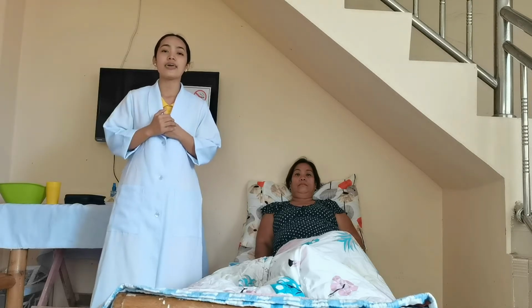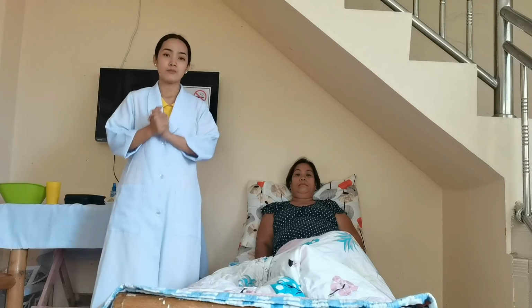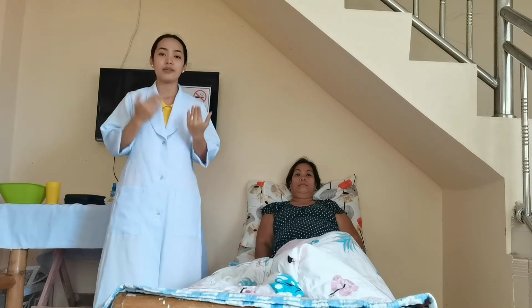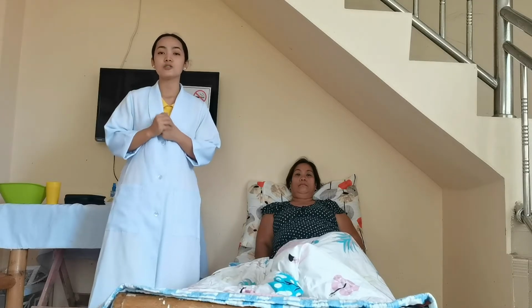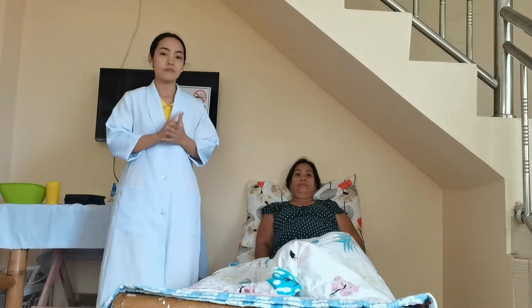So for the assessment, we have to assess the client's lung sound before and after the procedure to provide baseline data and also to assess the effectiveness of the medication. We also need to assess the client's oxygen saturation before administration of the medication. And lastly, we need to assess the client's level of consciousness to understand the procedure and the action of the medication that we are going to administer.